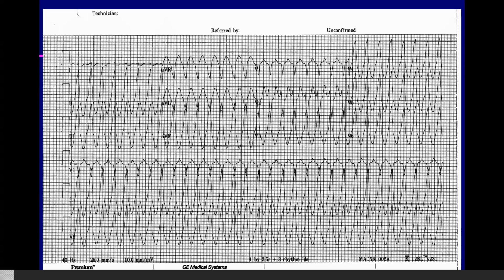So this is an outflow tract tachycardia. It could be the RVOT, but the transition is from V2 to V3, so this could be the aortic cusp or the left ventricular outflow tract. Even in these tachycardias, they're usually not quite as wide, and yet they have these huge tall R waves in the inferior leads, 2, 3, aVF, which screams outflow tract tachycardia. So this is probably coming from the aortic cusp or the left ventricular outflow tract. But also for these tachycardias, the morphology criteria still apply.